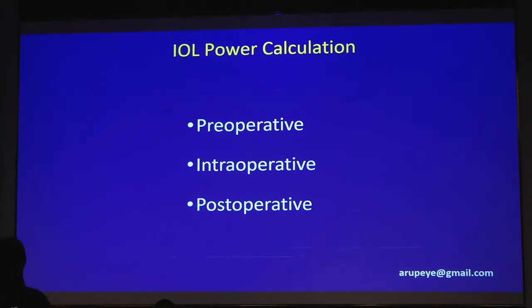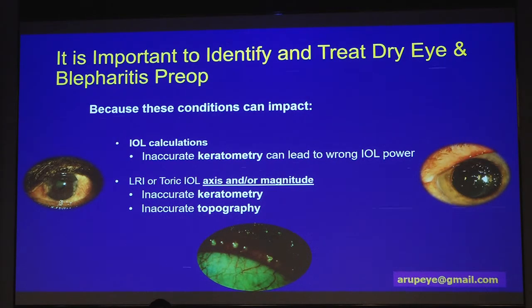What I realized a long time back is that IOL power calculation is not a one-off event in the history of a cataract surgery patient. It is not something that you tick off a preoperative checklist. It is an overall experience which pervades the preoperative, intraoperative, and postoperative period. Preoperatively, the bulk of the IOL calculation is done in this stage, but events in the intraoperative period and the postoperative outcome also have important bearing on overall IOL power calculation.